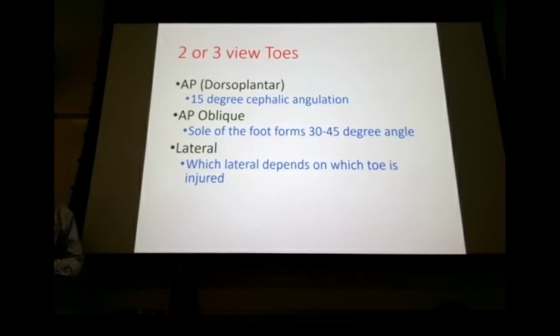But if you're doing a foot, then take a look at the shape of the foot. We tend to look at the bottom of the foot and determine flat-footedness off of that. Logically, that's kind of where it should be, right? But what you'll find is that some people have a flat bottom of the foot but still have a very steep arch, or a steep arch causing a pretty good wedge shape of the foot. In the book, they show the same model demonstrating flat-footedness, and all they're really doing is applying pressure to the foot to lower that arch a little bit.